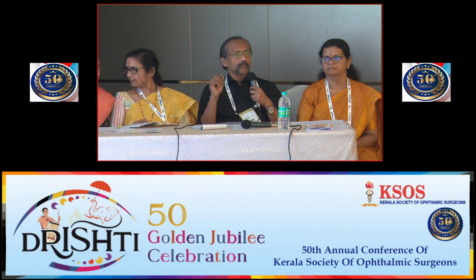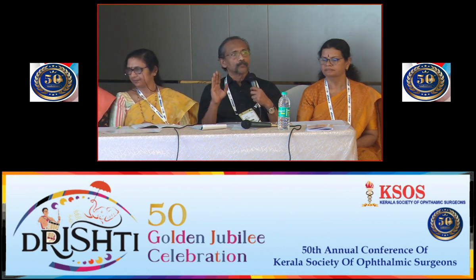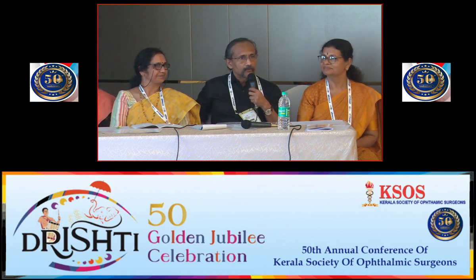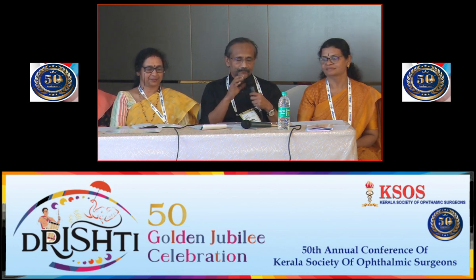I saw one of my patients, an MBBS student, a Malaysian student, 22 years back, who came in with severe conjunctivitis. I said, let me see your contact lens and the case. She put her hands into her jeans pocket and took out the lens, not the case. So I think teaching the patient hygiene is absolutely important.